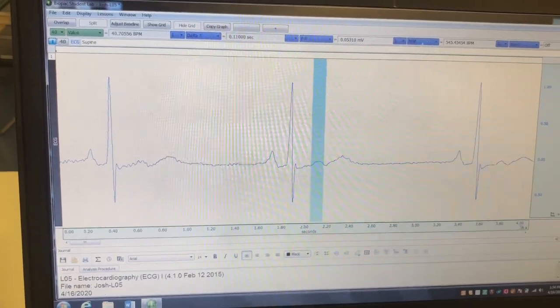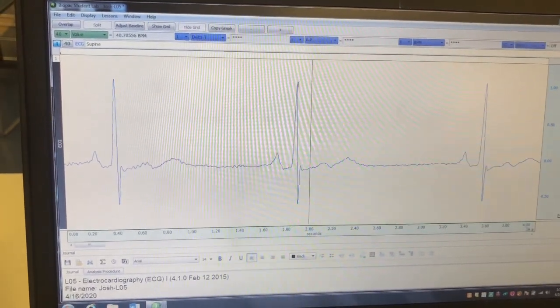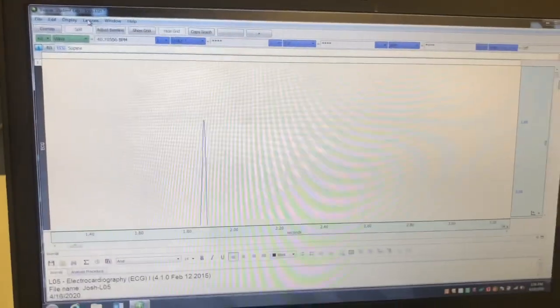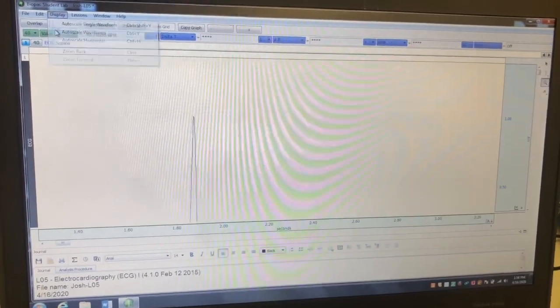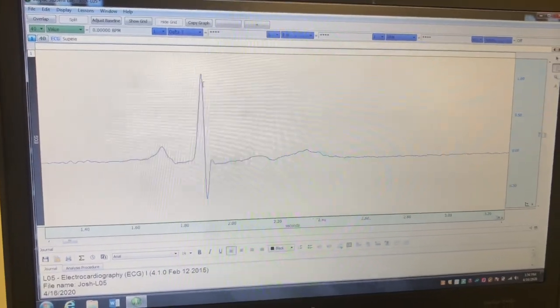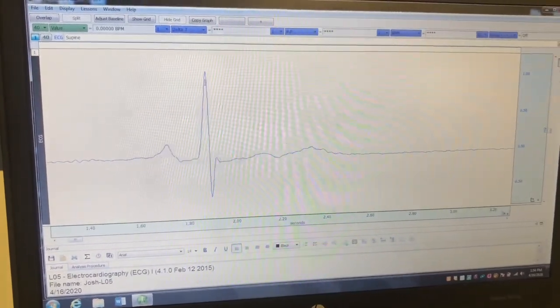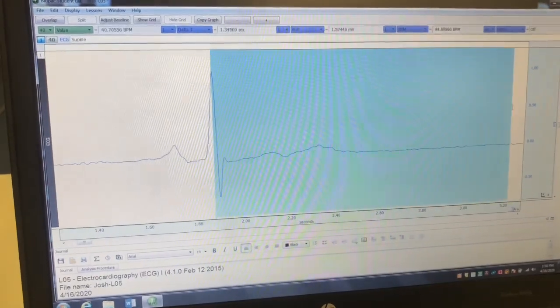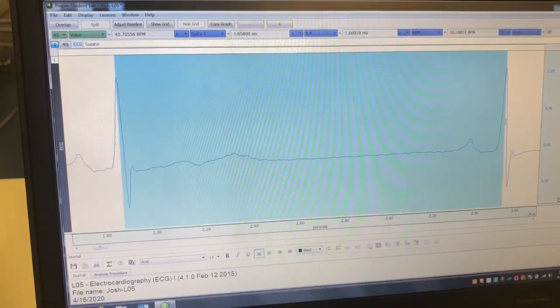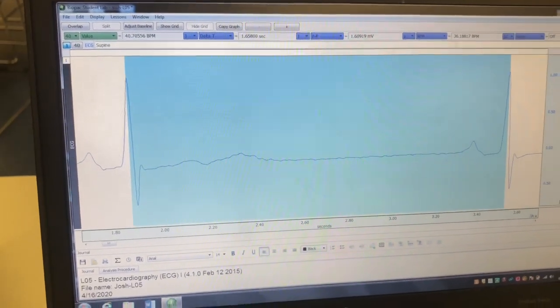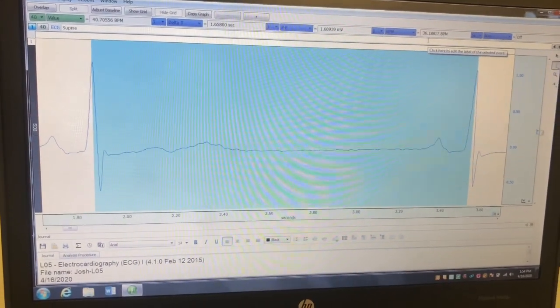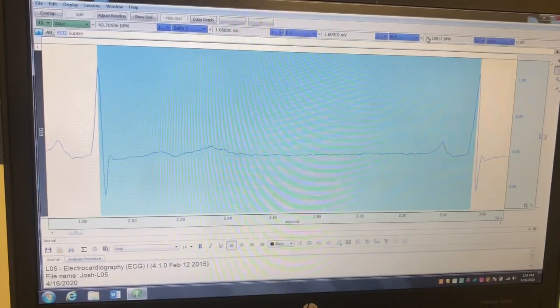The last thing you want to find is the heart rate in beats per minute, right here. You want to go R-to-R — here's an R wave, here's an R wave. I like to blow it up a little bit more so it's easier to grab. Take the R wave, try to get exactly on it — it's a little difficult — then go to that next R wave and that will show your beats per minute. It shows that while he was laying down, he had a resting heart rate of 36 beats per minute, which seems pretty low, but for him that's fairly normal.